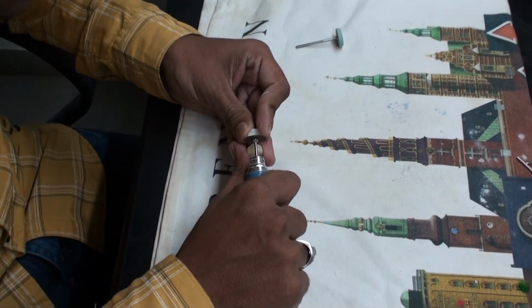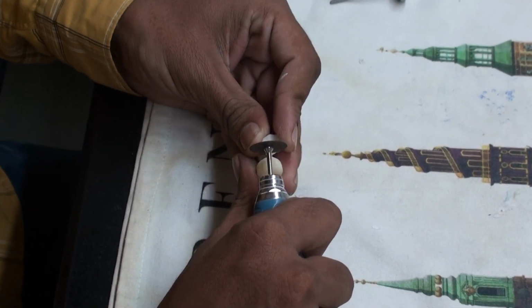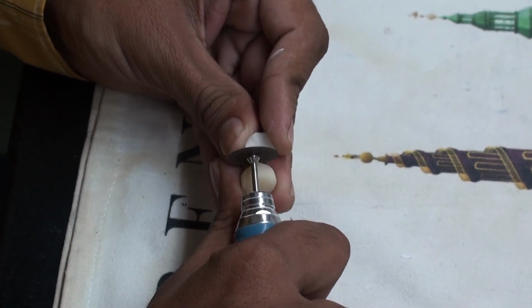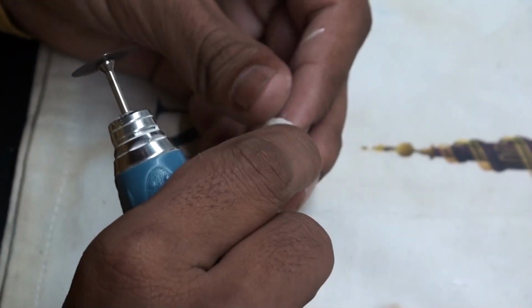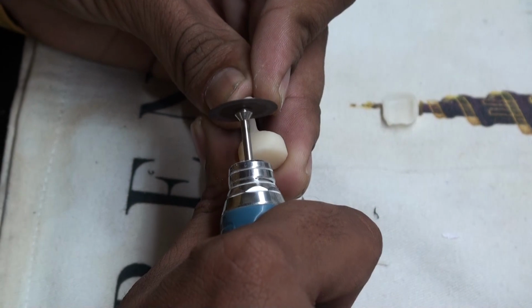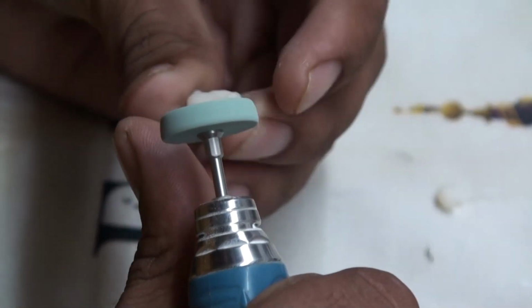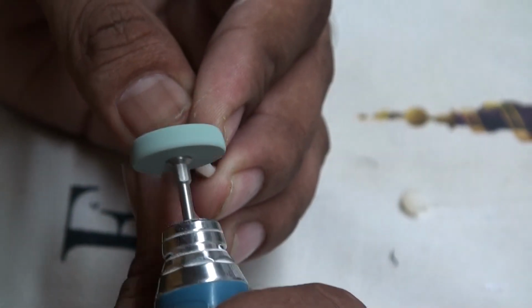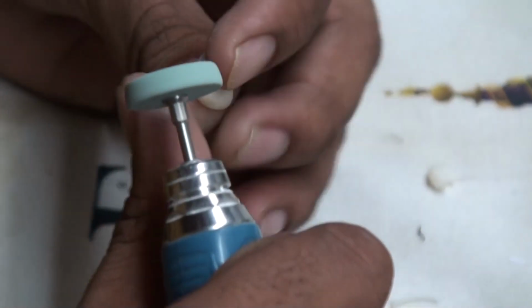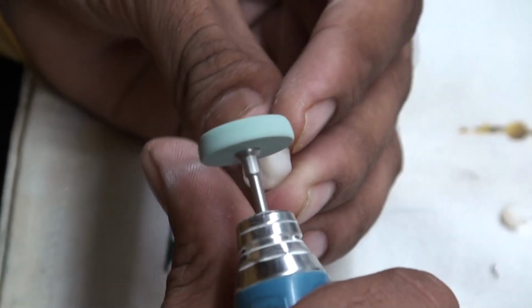There is a crown. So once it's all cleaned and taken out, you remove the sprue by just cutting it off with the disc. And there we go, that is our crown. Taking off the button. This is removing some excess, giving it some smoothing. As you can see, there's a lot of precision involved in all these steps.